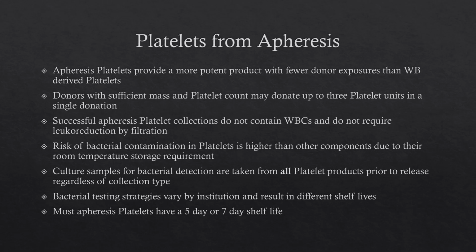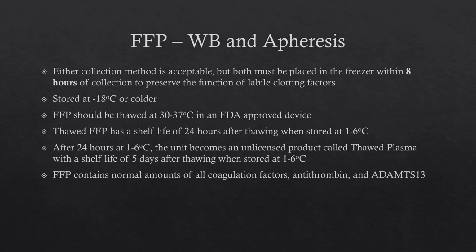There are different timing strategies for when to take your cultures, and it will result in either a 5-day platelet expiration or a 7-day shelf life. It just depends on the needs of the institution which strategy they adopt. But the takeaway is that you've got to take a culture from your platelet component to ensure that it is not bacterially contaminated.